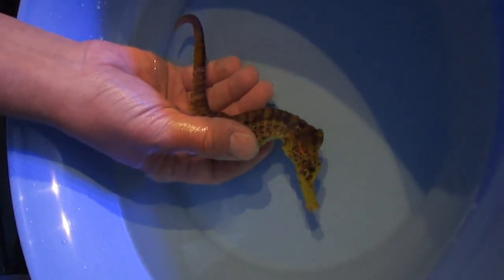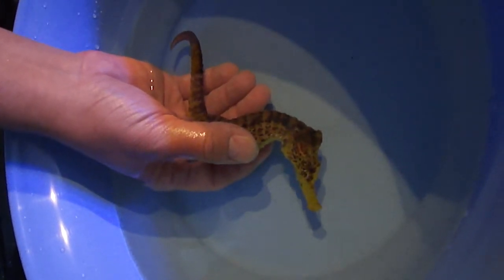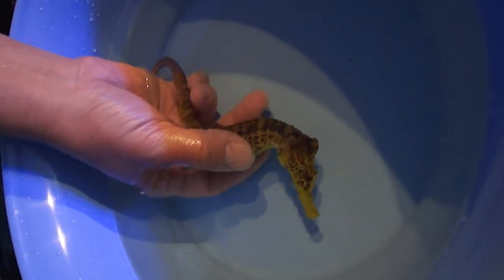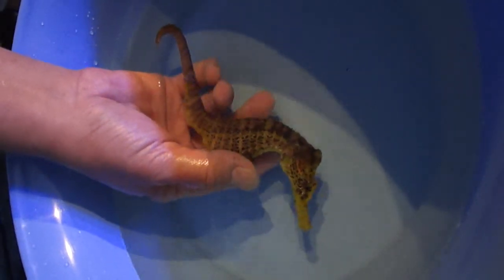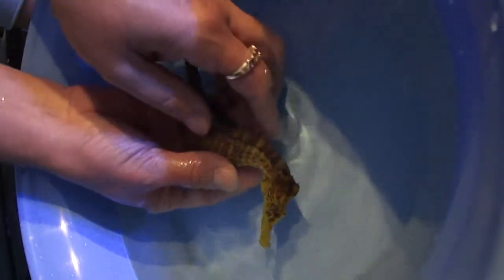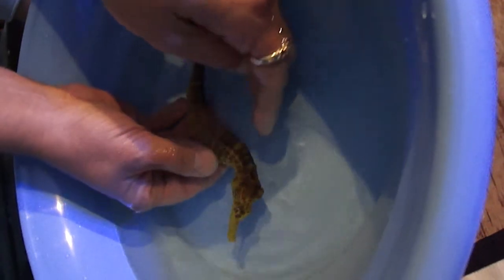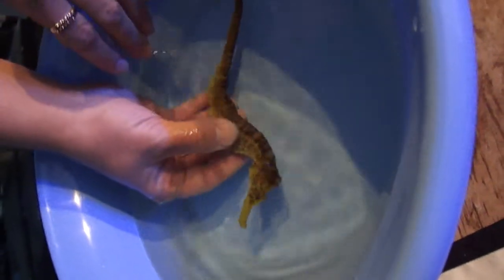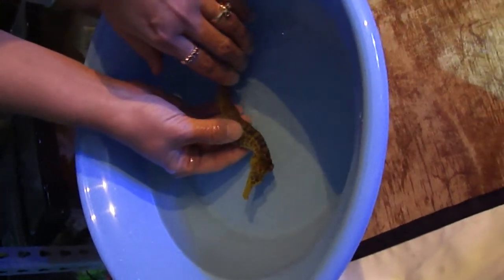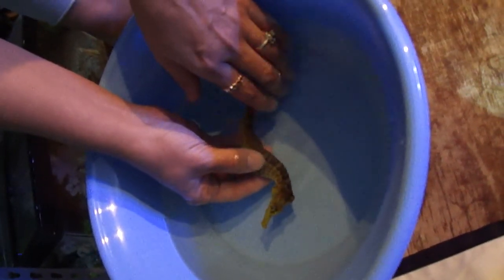The secret or trick to this is not to leave her in too long, because it'll actually put them to sleep — in fact euthanize them — so you don't want to do that. You just want to make sure she starts to become subdued. It looks like I've got her pretty subdued. Again, you don't want to euthanize, you just want to kind of take the fight out a little bit. She's still fighting because she's really pushing with her tail.